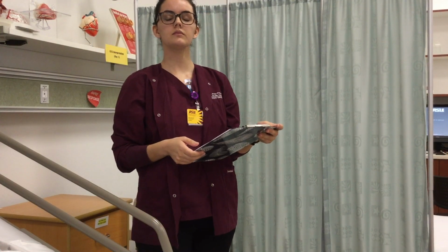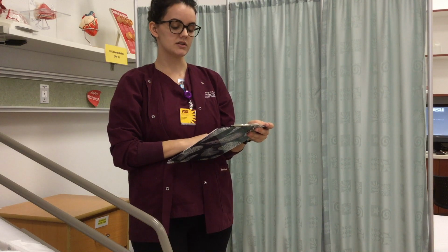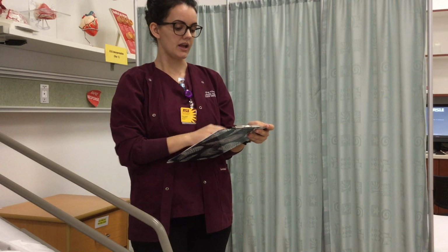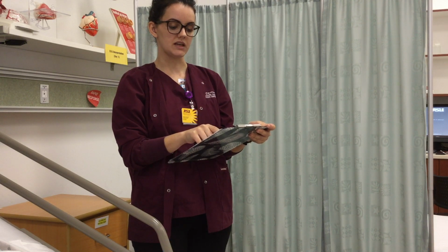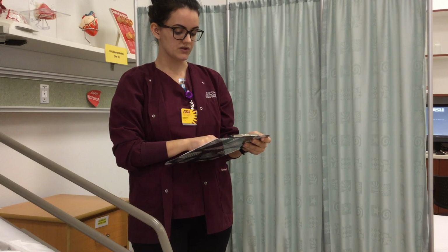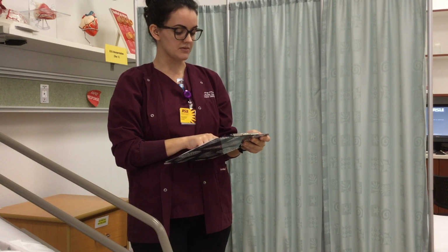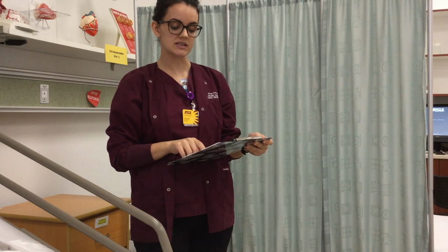To start, Kayla will verify orders from the doctor. So I'm looking at Chesty Chester's electronic medical record, and I have his MRN as 5986711 and his date of birth as 5/15/1989. I do have orders from the physician for labs including a CBC, a BMP, and cardiac enzymes stat.